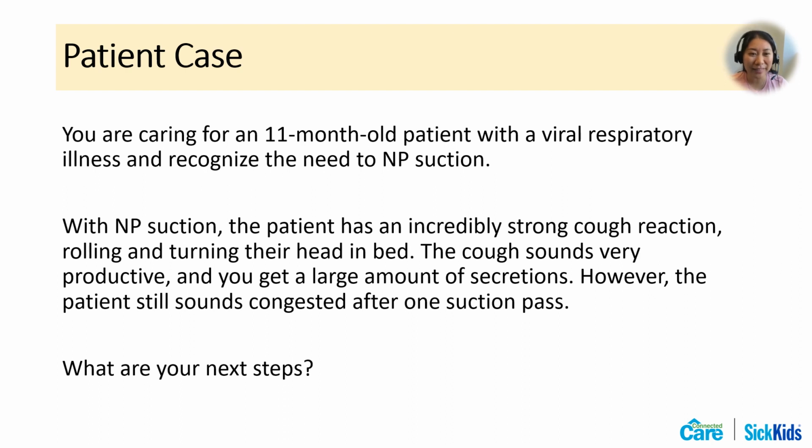Excellent thinking. Let's discuss our next steps. The patient likely still needs more suctioning. Consider getting help from the family or others to hold the patient's hand or bundle to ensure effective suctioning. Consider another less irritating route or reevaluate the depth if you think it's possibly gone in too far.